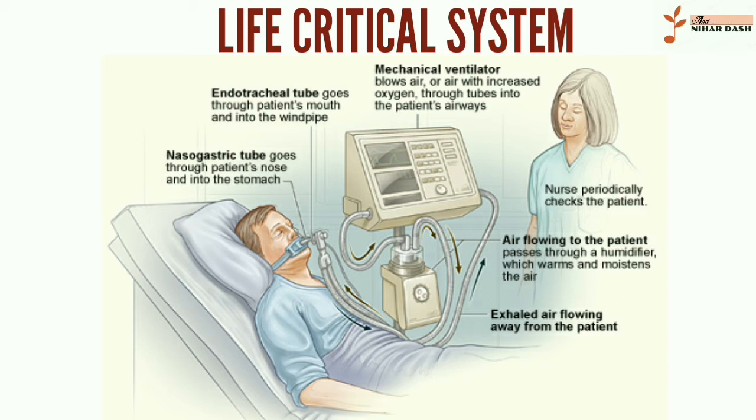They may have manual backup mechanisms to enable hand-driven respiration in the absence of power, such as the mechanical ventilator integrated into an anesthetic machine. They may also have safety valves, which open to atmosphere in the absence of power, to act as an anti-suffocation valve for spontaneous breathing of a patient. Some systems are also equipped with compressed gas tanks, air compressors, or backup batteries to provide ventilation in case of power failure or defective gas supplies, and methods to operate or call for help if their mechanisms or software fail.